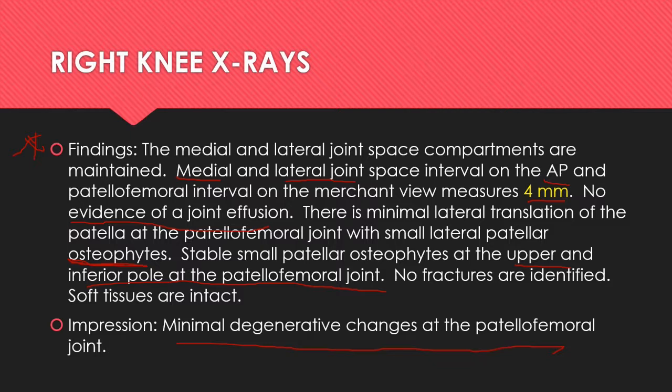But during the course of reviewing these x-ray studies for the assessment of post-traumatic arthritis, some interesting findings were recorded. And it's the interesting findings more so than the cartilage interval measurements that are going to contribute to this particular examinee's permanent impairment rating. And we'll go over that in just a couple moments.